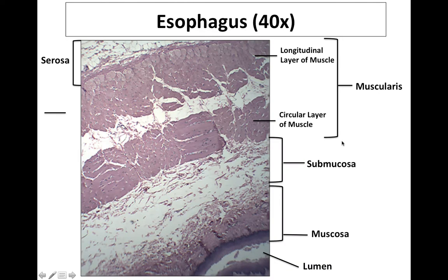So as we look at the esophagus, we begin to see this breakdown of the tunics themselves. If we look here at the very bottom of the screen, we can see the lumen. Now the esophagus gets compressed easily, so here the lumen doesn't look super round. But you can identify right there that lining the lumen itself, you're going to see the mucosa. So really nice coloring of the mucosa right through here. The submucosa running up with connective tissue in this direction. And then the muscularis layer itself. You can see the serosa out here on the very outside. This is going to be bordered by fat, which gets included with serosa pretty frequently.